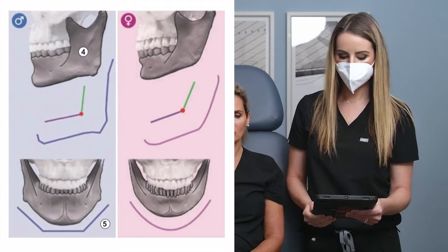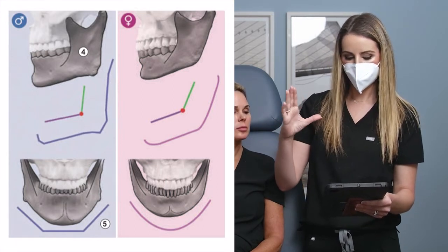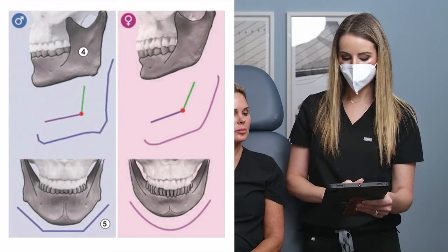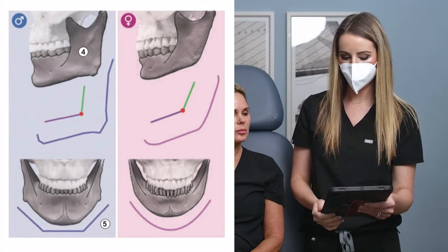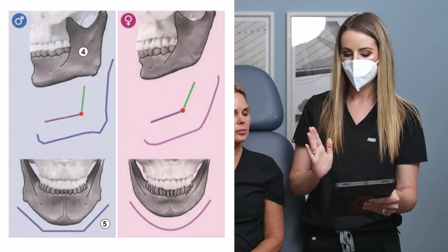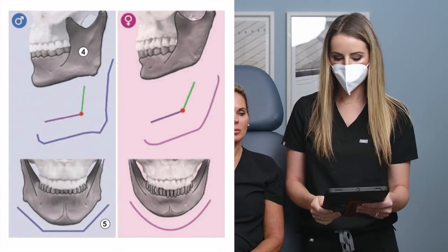In this photo, you can see how the male jawline is more square or boxy. And even if you look at the chin, it's more straight and not as rounded. And then when you look at the female jawline, it has a different angle. There's more of an angle this way versus up and down. So our goal today is to keep it feminine and just really lift. The goal is to help with this jowling and give her that etched, defined, projected chin that she had in her 30s.